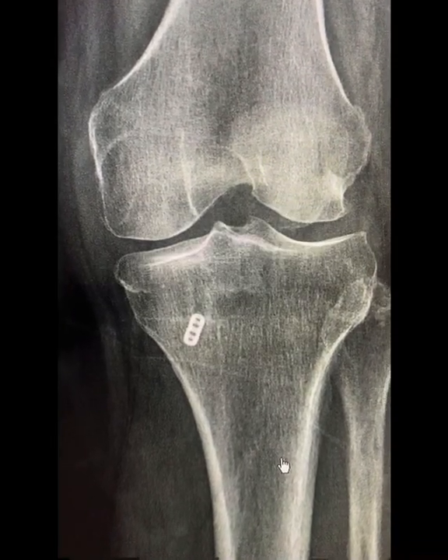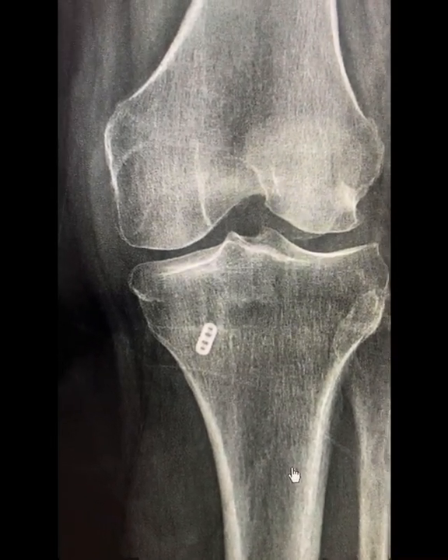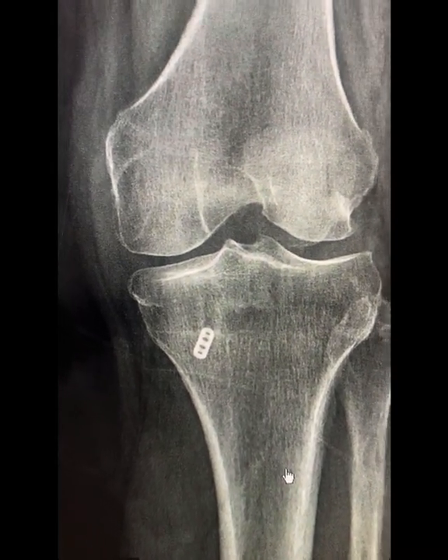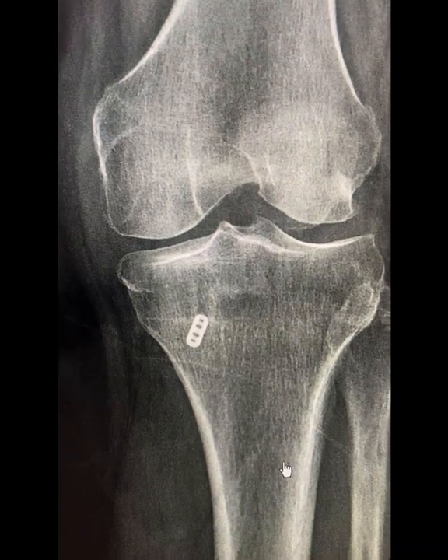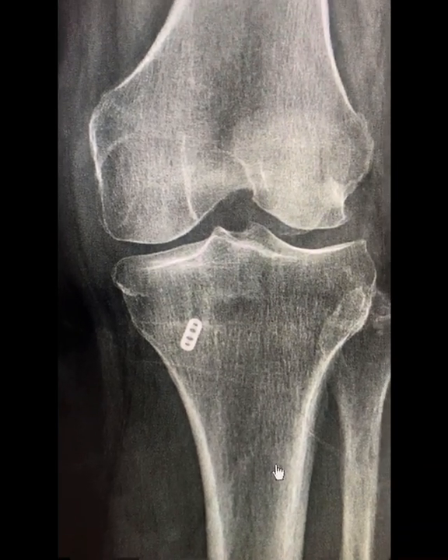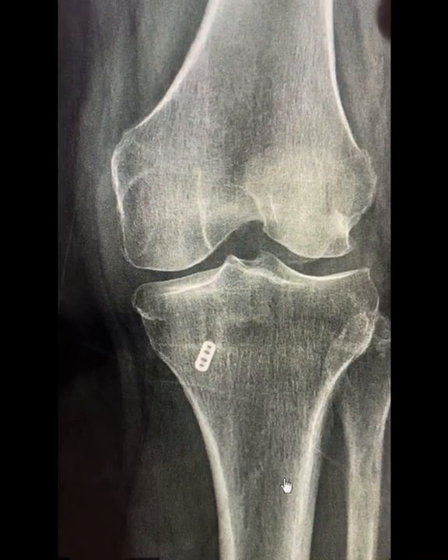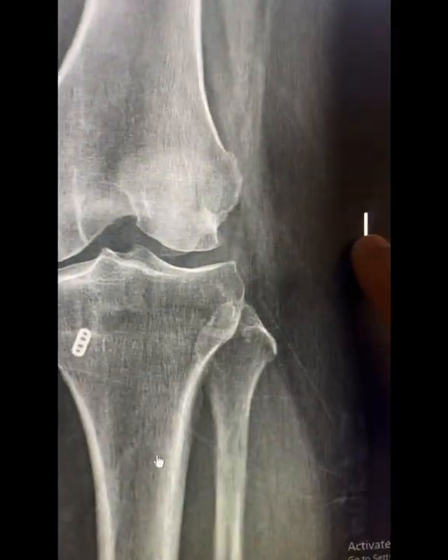Hi everybody, this is Dr. Mora. I wanted to show you a follow-up case. This is an X-ray of a 50-year-old patient of mine. I did a medial meniscus root repair on her a year ago. She came in for a routine visit and I wanted to get an X-ray to see how her knee was doing. This is the X-ray of her left knee.